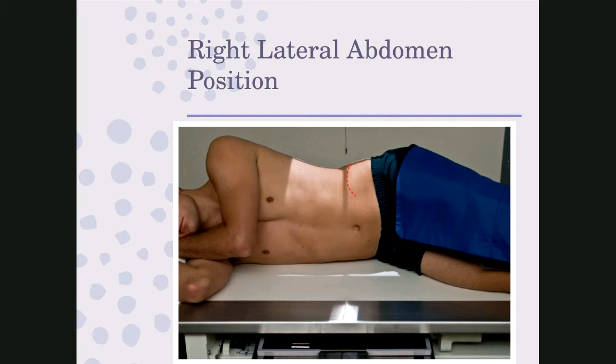Again, the central ray is not correct. The central ray should be 2 inches above iliac crest and midline. Not sure why they printed this entire book with all of those incorrect, but make sure that you look and note that it should be 2 inches above iliac crest and midline. This is done for any abnormal soft tissue masses, an umbilical hernia, to evaluate for aneurysms in the aorta. You could also do this if you were trying to localize a foreign body that maybe the patient swallowed.